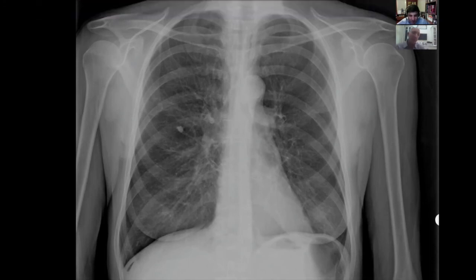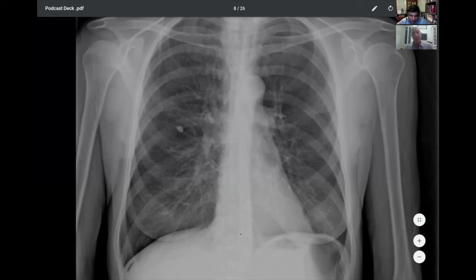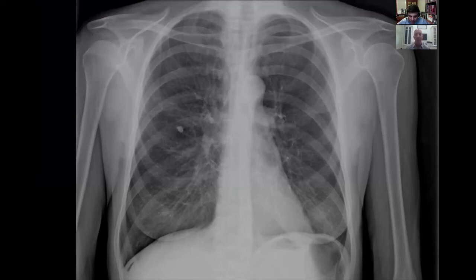This patient went to the hospital. They had a perforated viscus, and they had a really difficult medical course. But this was in fact the only finding at chest X-ray on presentation: a sliver of air. So these are the types of things, as you mentioned, with pneumothorax that you just don't want to miss. They're really important. They're not that common, but you've got to be aware of them. And when you're doing your search pattern, those are the things you've got to be on the lookout for.